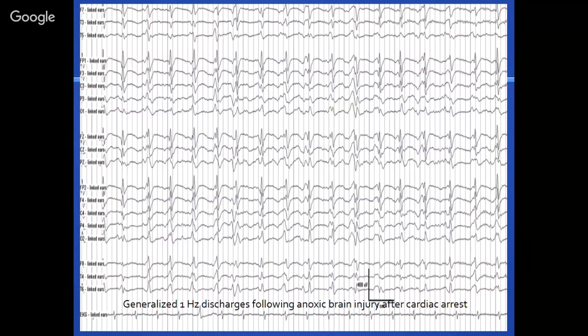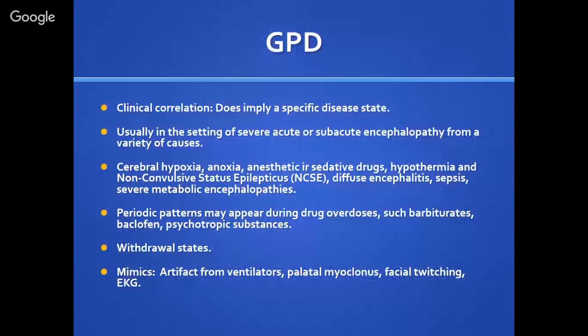Actually, which has a better prognosis? Generalized periodic discharges or lateralized periodic discharges? Which one? You said lateralized has a better prognosis? More likely not. I think generalized periodic discharges more likely have a better prognosis.